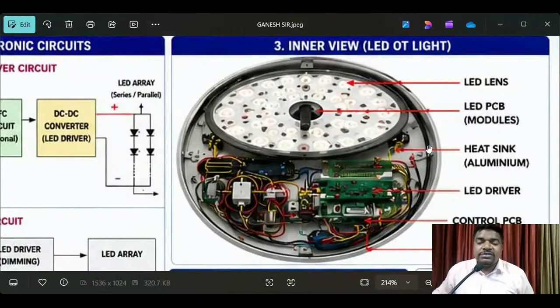Why am I giving the names of all these parts? Because you have to know. Whenever we get a complaint, we cannot imagine in which way or where the fault is. If I give the instructions, you come to know the valid points, then you can catch the problem, diagnose it, replace the spare part and make it work again. Ultimately, you should be a problem-solver engineer. I hope you got it very clear.